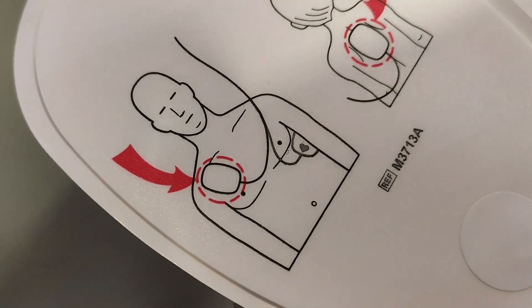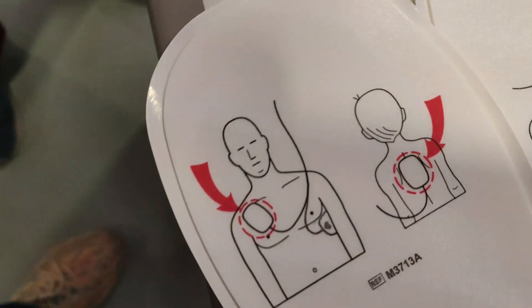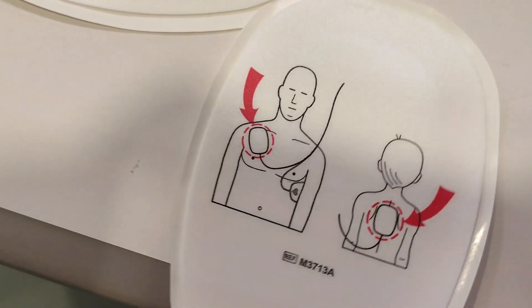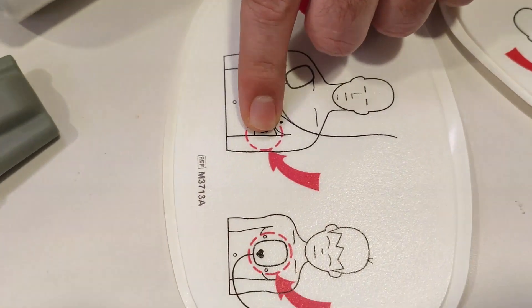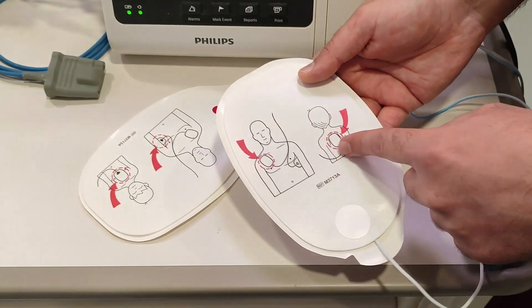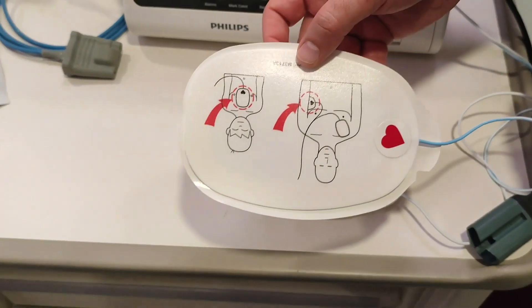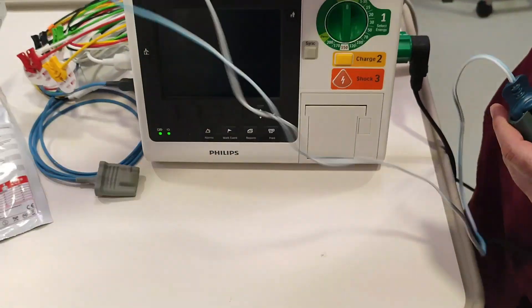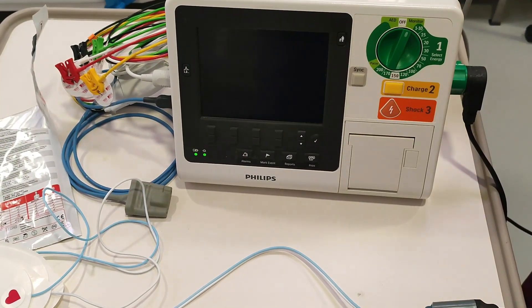This will be connected to the disposable pads. Open them — there are two chest pads and a connection. There is an indication here: if you are using it for an adult, the one with the arrow goes to the patient's upper chest, and the other one goes to the mid-axillary line. If you are using it for a child, put one on the back and the other on the mid-anterior chest. Connect this and apply the chest pads on the patient's chest.